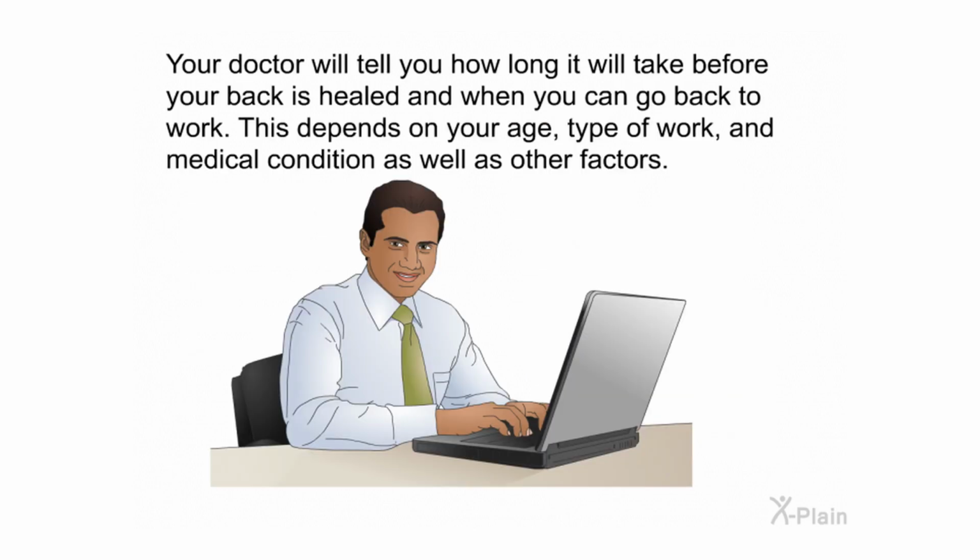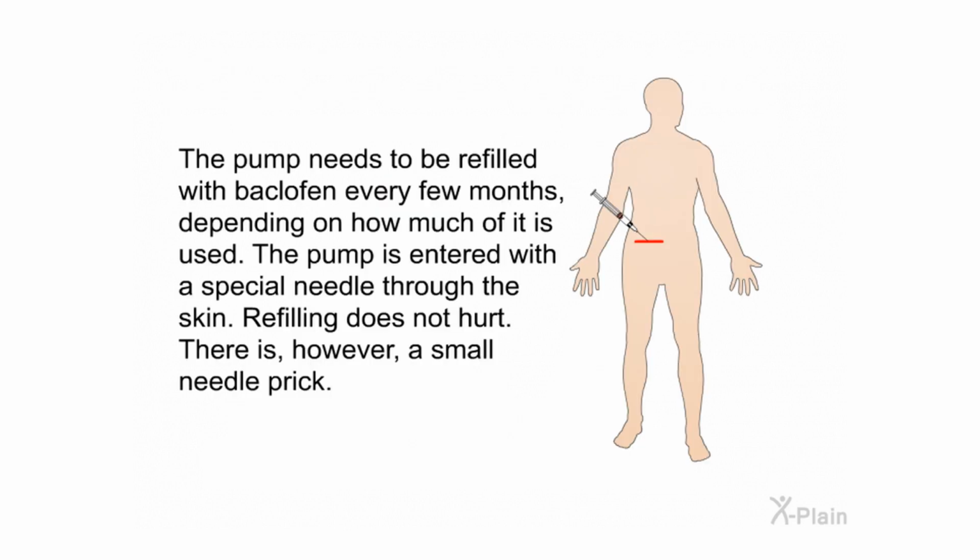Your doctor will tell you how long it will take before your back is healed and when you can go back to work. This depends on your age, type of work, and medical condition, as well as other factors. The pump needs to be refilled with baclofen every few months depending on how much of it is used. The pump is entered with a special needle through the skin. Refilling does not hurt. There is, however, a small needle prick.